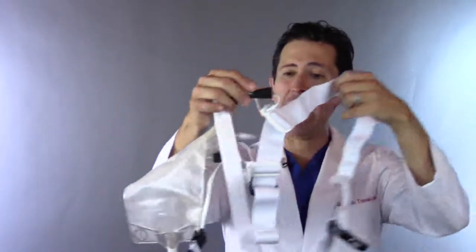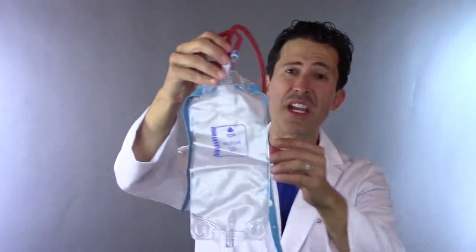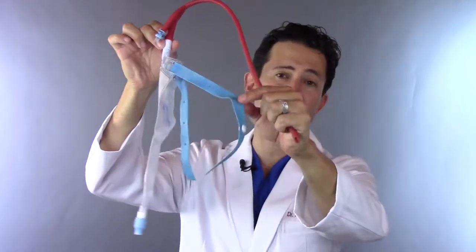The next tip that I'm giving you is the following. If you do not have a suspension system such as the one that I invented — Freedom Belt — that allows you to carry your bag in a customized and easy way, you probably are using the typical way, which is a drainage bag that has the straps.